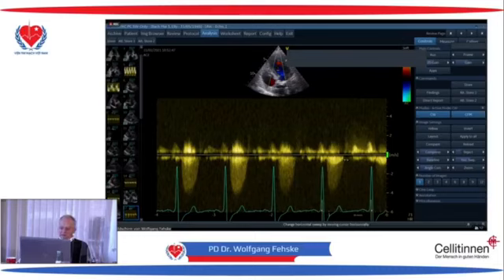This is V1, and this is the velocity inside the valve, it is V2. So what we do is that we look for the acceleration, and this shows us dramatically that she's symptomatic. This is not a steep increase in velocity. This is parabolic flow, and then we have this here.